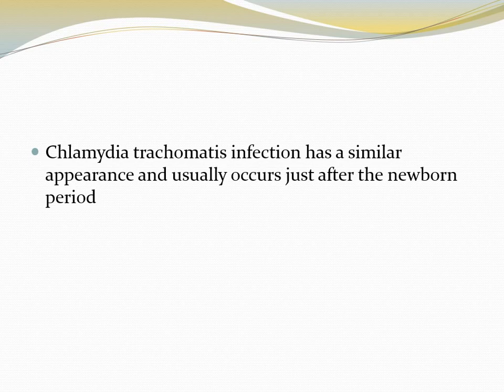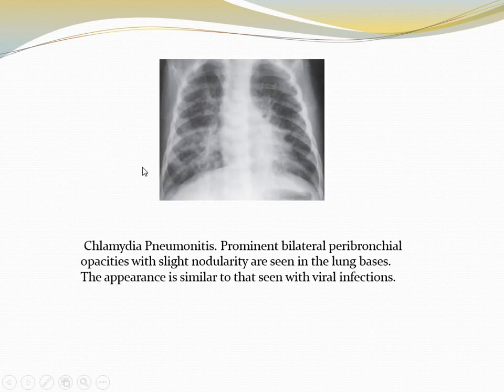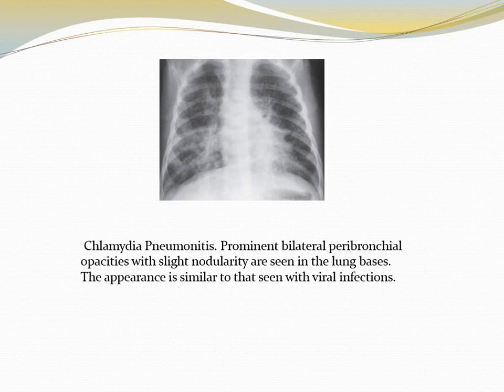Chlamydia trachomatis infection has a similar appearance and usually occurs just after the newborn period. Prominent peribronchial opacities with slight nodularity are seen in the lung bases. When you see peribronchial, ill-defined, shaggy heart appearance, this indicates some sort of atypical infection like viral pneumonia or mycoplasma pneumonia. While we see airspace opacification with air bronchogram and consolidation, there is no sign of volume loss.